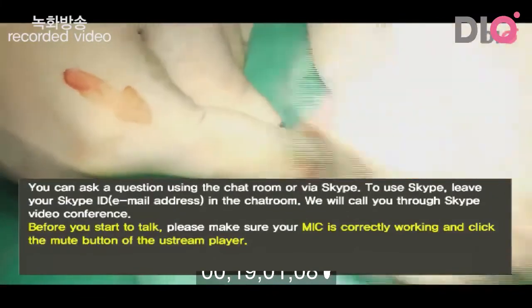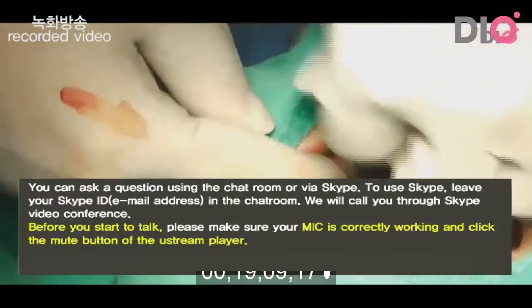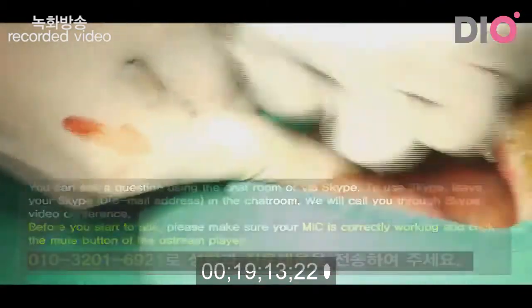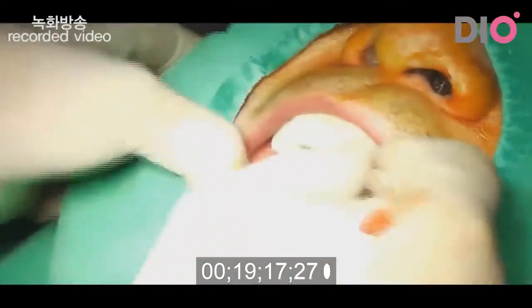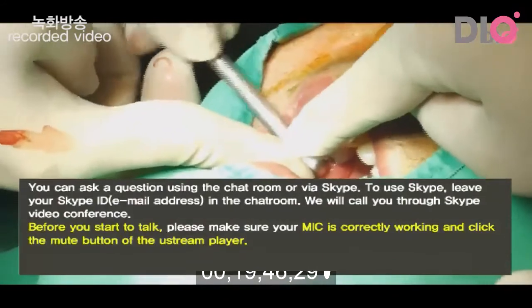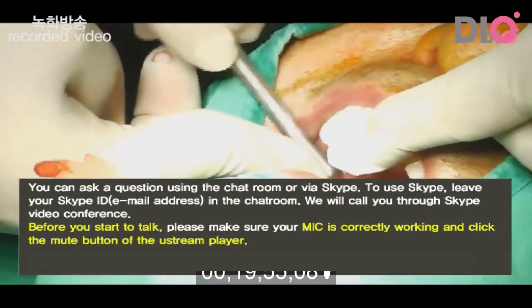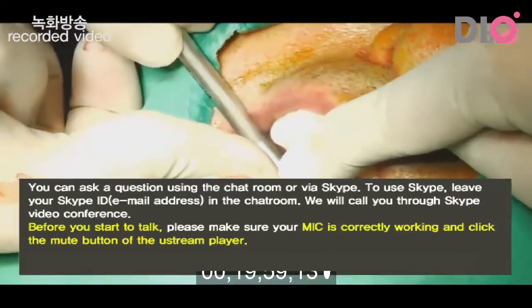Because of the limited mouth opening, I have to use this one. Okay, mouth corner. This one, vertical height. I control the vertical height of the implant.